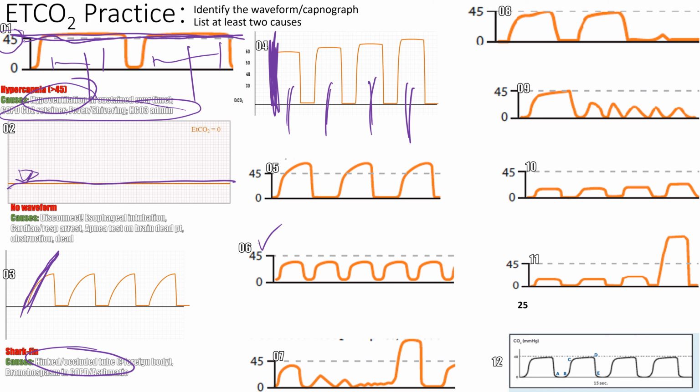Whereas someone with, you expect a lower waveform. If it's that in a Kussmaul patient, that's bad. But to your point that you told me, someone could have Kussmaul respirations, but the tidal volumes are getting less and less over time, right? So someone is breathing fast but with poor tidal volumes, right? I'm not sure if I put that here in the item. So yeah, fast rate, low tidal volumes.